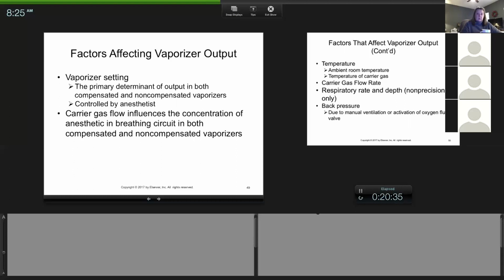I have a question about that whole temp thing. Is there like a heating element or something? How is the temperature controlled? Yes, they're inside, even though it's not plugged into anything. There is, because it's insulated. I don't know, to be honest, I'd love to see the inside of a vaporizer. I've never seen it. But the parts and the insulation do keep it at a more consistent temperature. So I think it's more insulated, not that there's necessarily a heating element, because it's not plugged into anything that would keep the heat going.